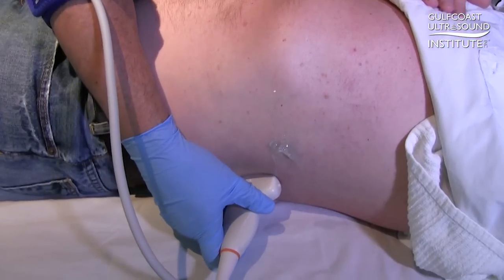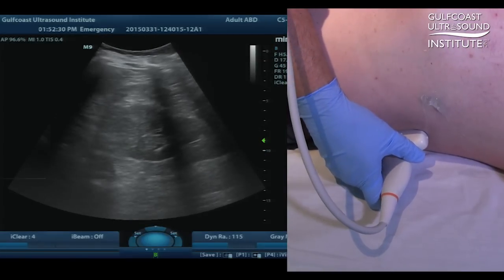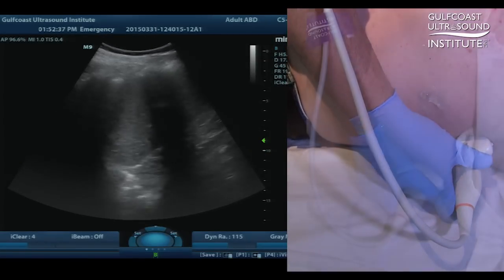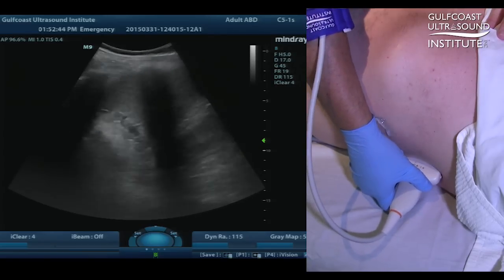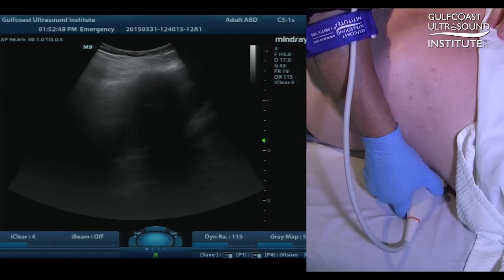Now repeat after me. Place your hand on the bed, up towards the head. So this scanning technique will help you find the spleen because the spleen is posterior. You place your hand on the bed and it's up high, go toward the head, and it helps you find the spleen.